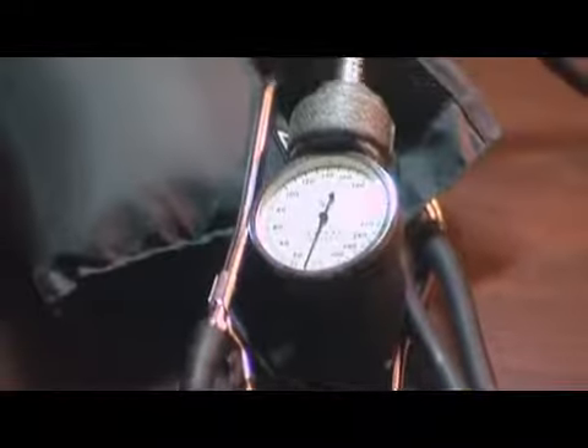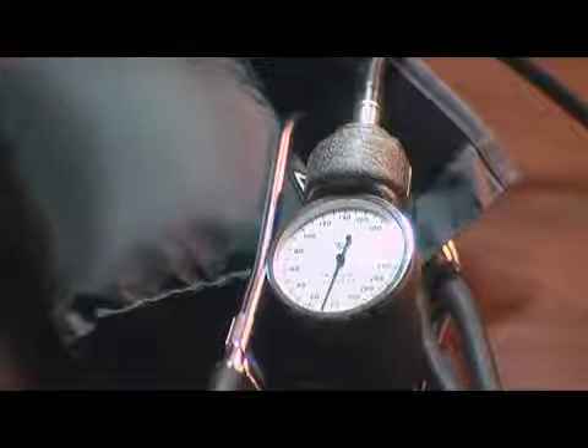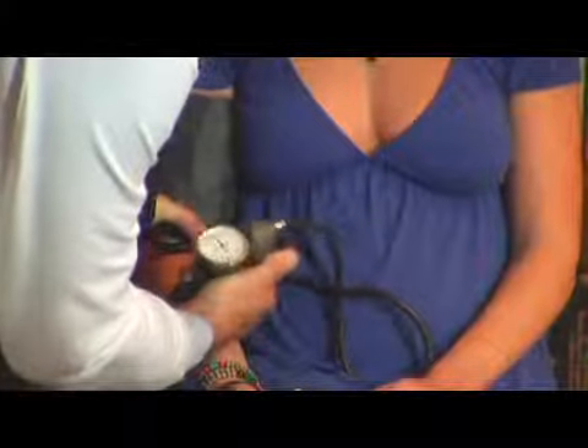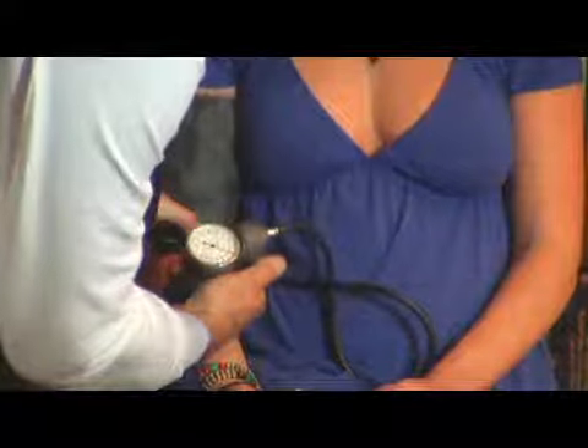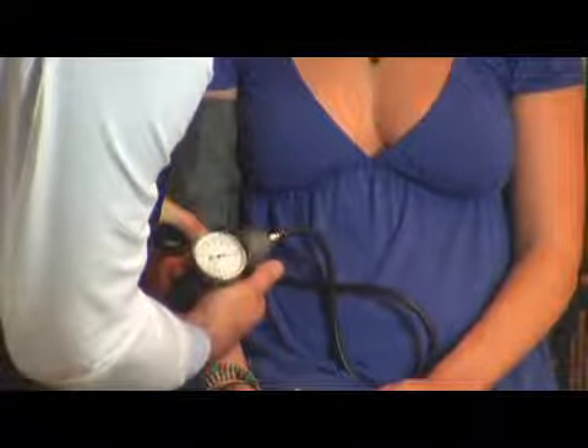The blood pressure is measured by use of an air bladder that goes around your arm snugly, and then it has a sphygmomanometer, which is an air pressure monitoring gauge calibrated to millimeters of mercury. You pump up the blood pressure cuff, or air bladder, to actually stop the flow of blood in the arm.